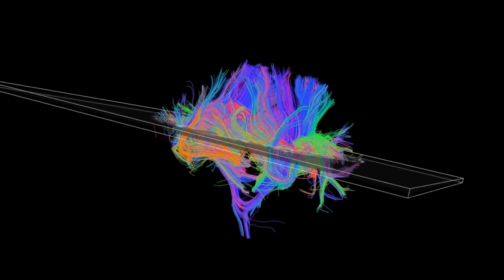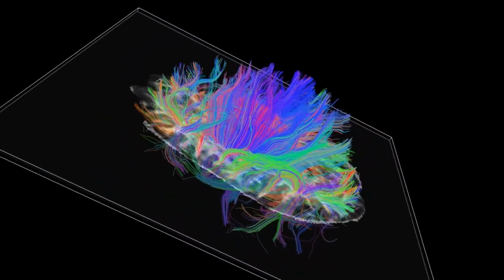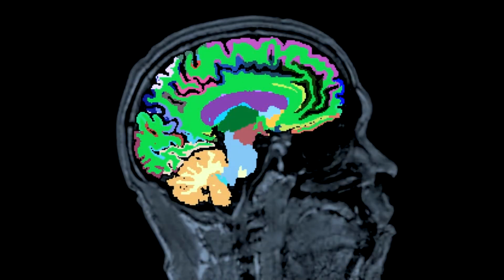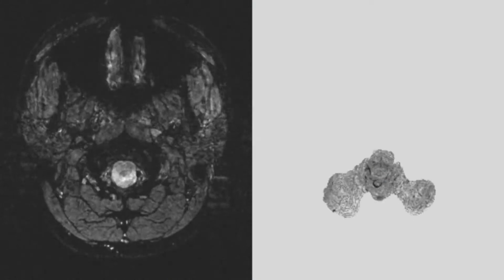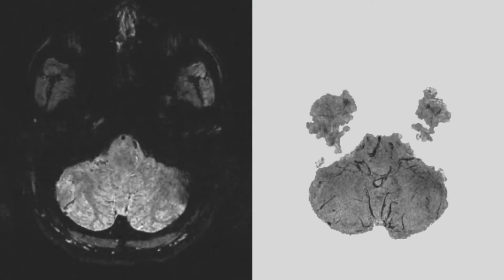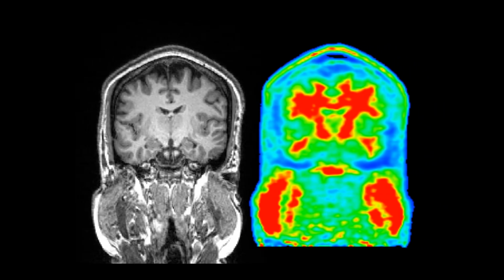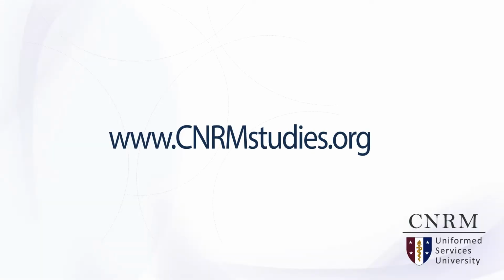And then there's also a large number of quantitative measurements that characterize how well connected different regions within the brain are to each other. And we can compare that across individuals, between healthy individuals and unhealthy individuals, and see what the differences are. So if there's a healing process or repairing process, we can monitor that, especially if there's a therapy that's being administered to the patient.